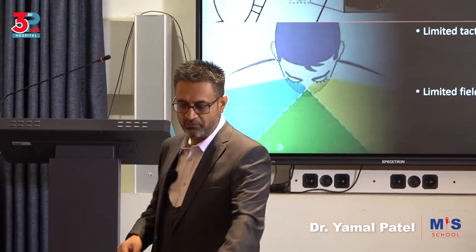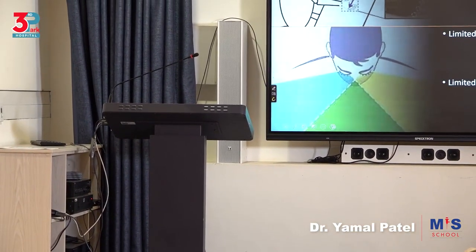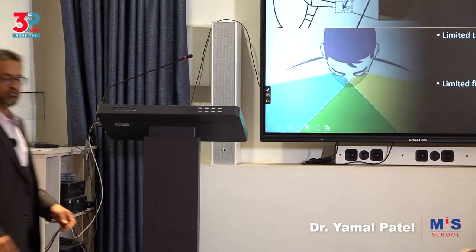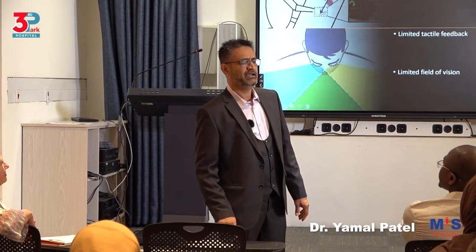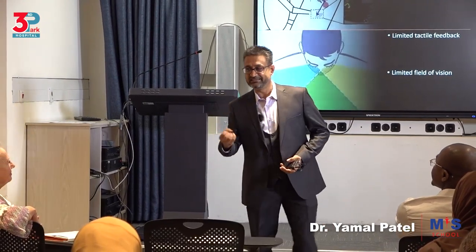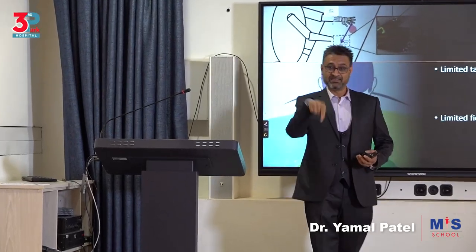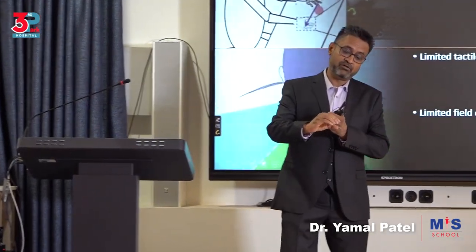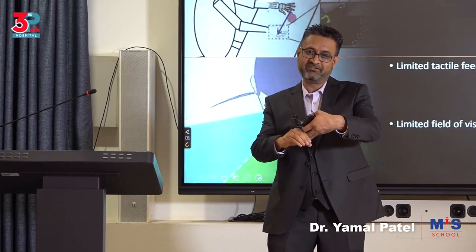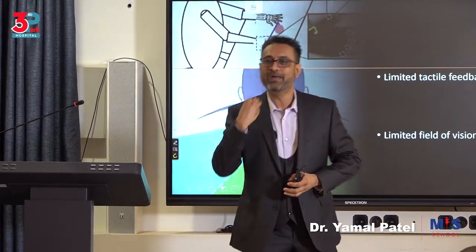Now, the same thing with the laparoscopic instrument. If I am taking an instrument and I'm going to be doing this, I don't care how experienced I am. I may not be able to tell you exact consistency, how firm it is, what is the exact shape in there, especially if it's a fibroid inside in the myometrium. Unless you have pre-planned and mapped it, you may not know where it is.